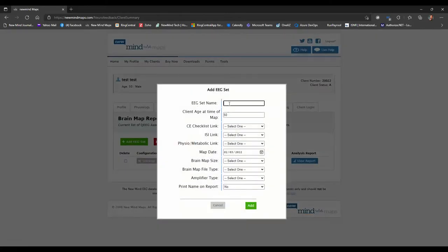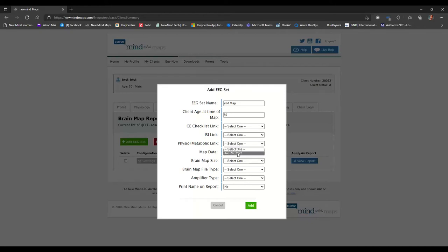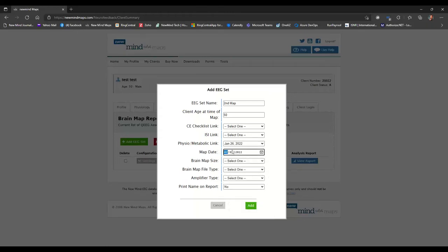So to manually upload these to the database, we would have to start by clicking the add EEG set button. And then it needs a set name. So that's that name we were just looking at. So let's assume this is now the second map. And then again, if they've done the surveys, which they should have done by now, we can link those in. Map date. If it wasn't recorded today, we have the calendar. We can change that.